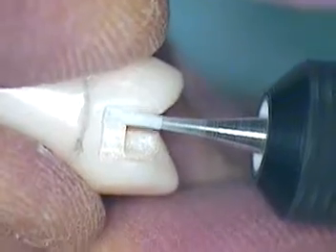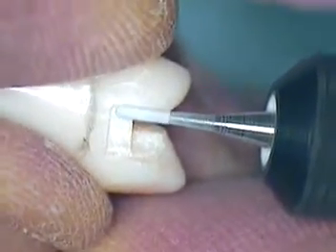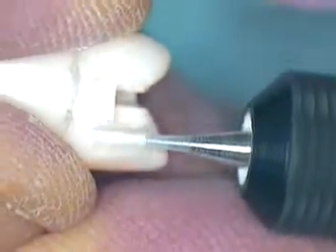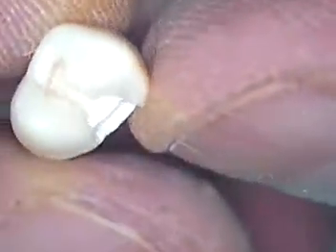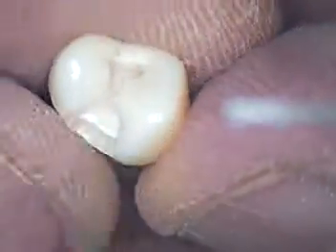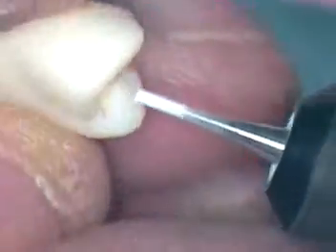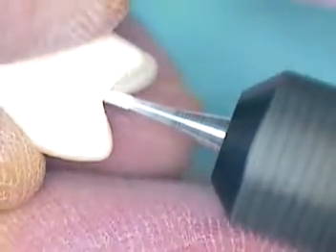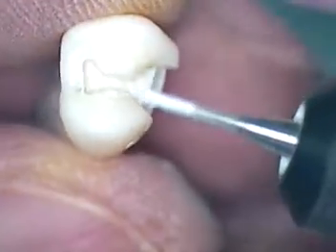That helped. A little off the road there — that's normal, though. Normally I get a little bit of scratches here and there, but keep practicing. That's about as close as where I want to be. Internally I like to see it all nice and smooth and polished. I like it to flow, kind of like an S internally as well.